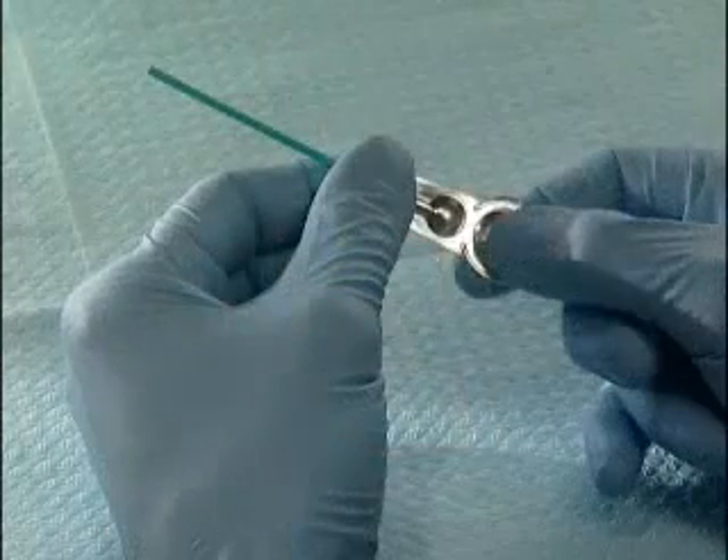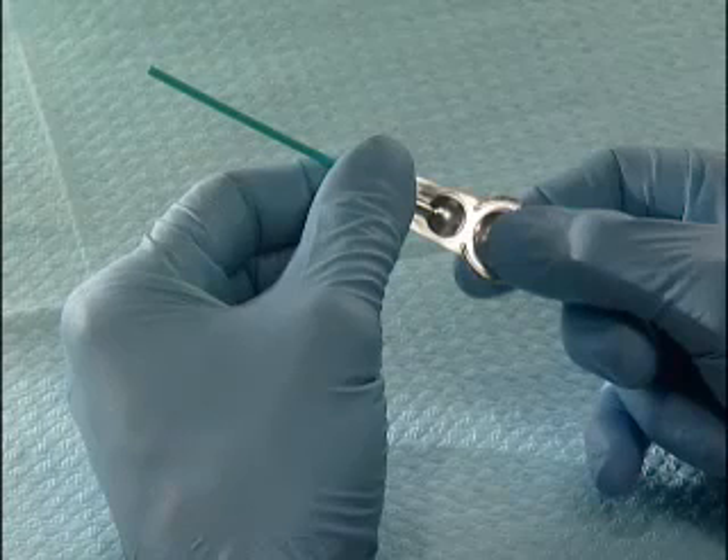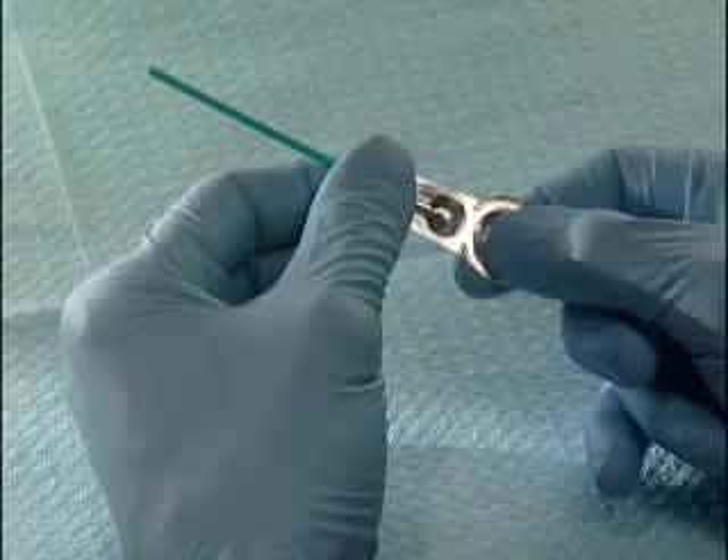For unit dose dispensing, hold the shaft of the disposable applicator with one hand, covering the blister opening with your thumb. This will prevent the adhesive liquid from splashing out.